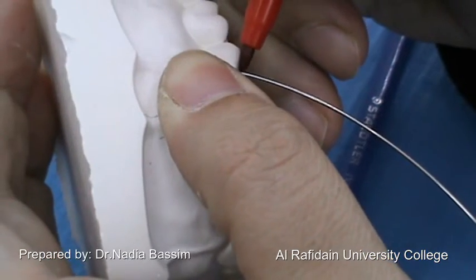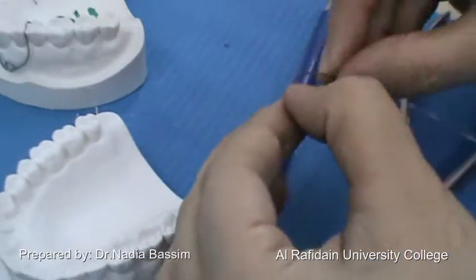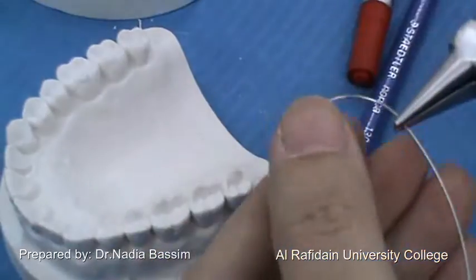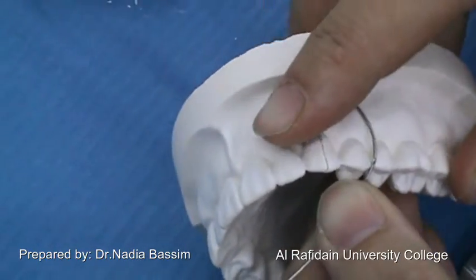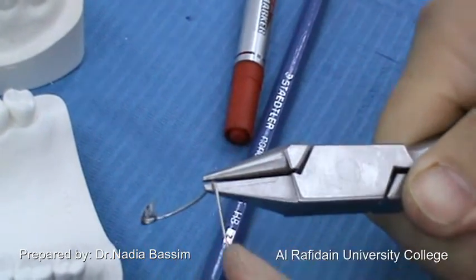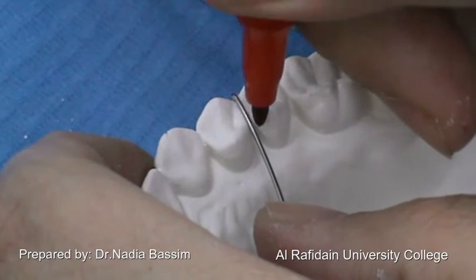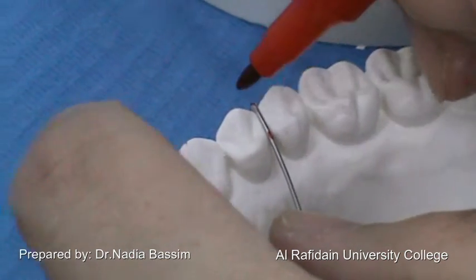Now we are going to mark the contact between the first and second premolars to start the occlusal part of the spring. I am going to make a right angle bend — we can make a trial bend to make sure we have the correct position and marking. Just a small bend in the wire to make sure our position is right. If it is correct, we are going to complete it. The occlusal part should be well adapted; we have to remember the gauge of the wire is 0.7 mm, so it should be well adapted interocclusal to prevent interference with the opposing teeth.